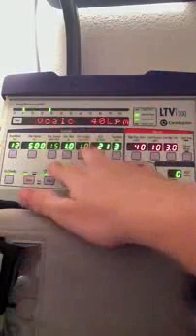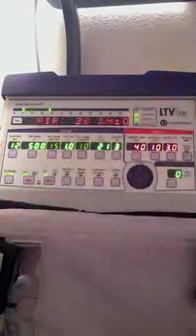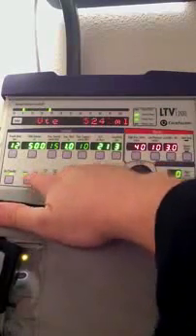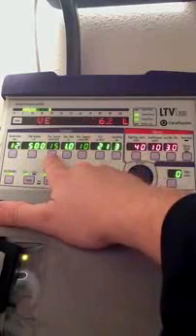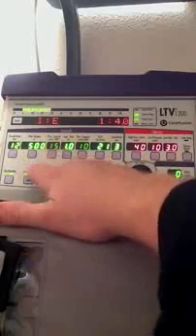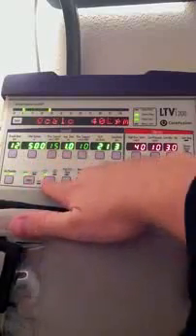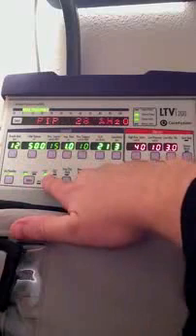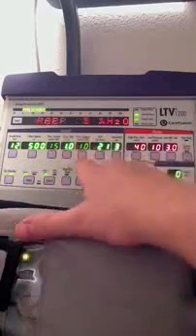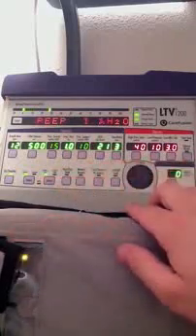If you see something dimmed out, that means it's something you can't use in the current mode or the current type of ventilation you're using. You can see over here that I'm in volume control ventilation, so my pressure control is dimmed out because there's no need for it. You can also see that my mode is assist control, so my pressure support is dimmed out because there's simply no need for pressure support in assist control ventilation.